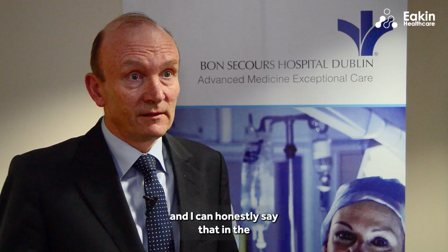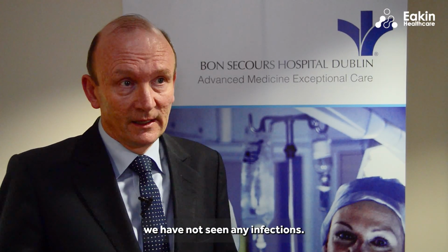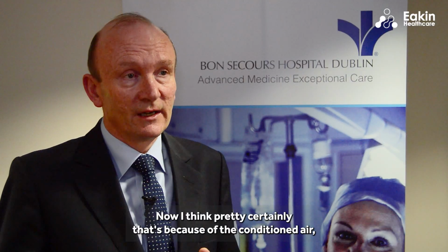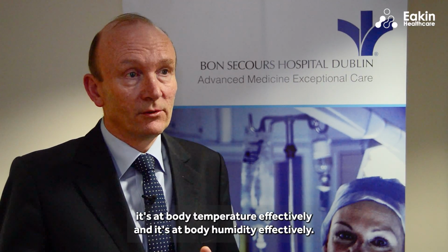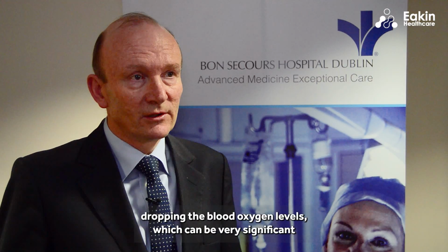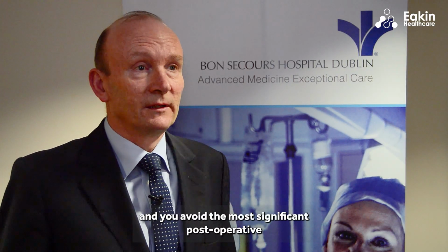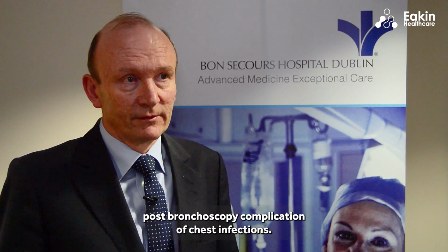And I can honestly say that in the first couple of hundred we've done in the past 6 months, we have not seen any infections. And I think pretty certainly that's because of the conditioned air. That's to say, it's at body temperature effectively, and it's at body humidity effectively. So the two great advantages are you avoid dropping the blood oxygen levels, which can be very significant, and you avoid the most significant post-operative or post-bronchoscopy complication of chest infections.